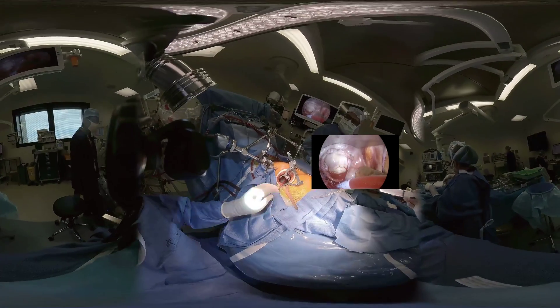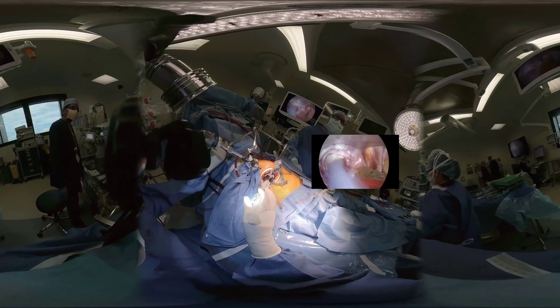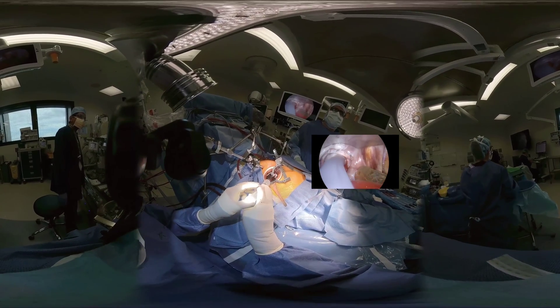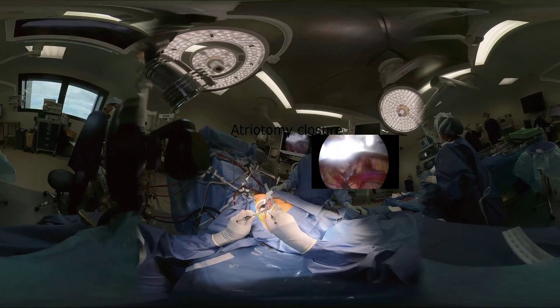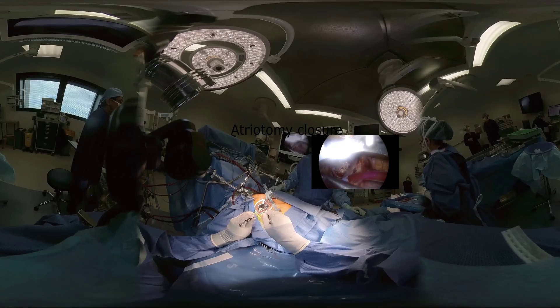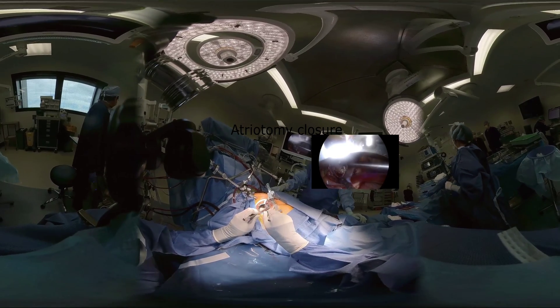Water pressure test shows good competence of the repaired valve. The atriotomy is closed with a Prolene suture starting from either end and knotting halfway.